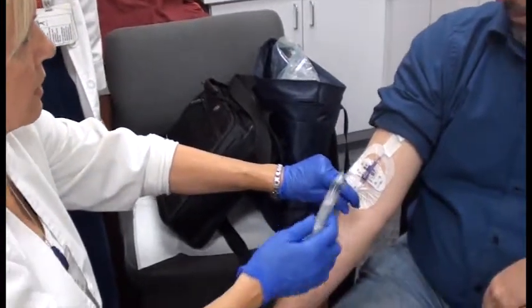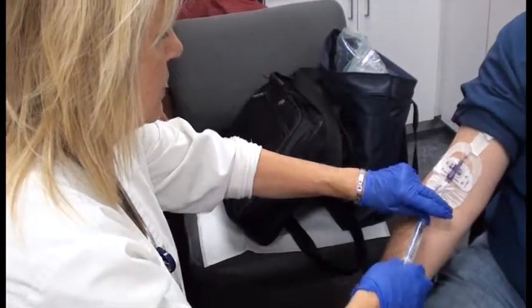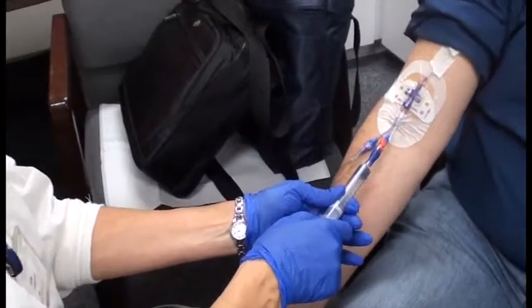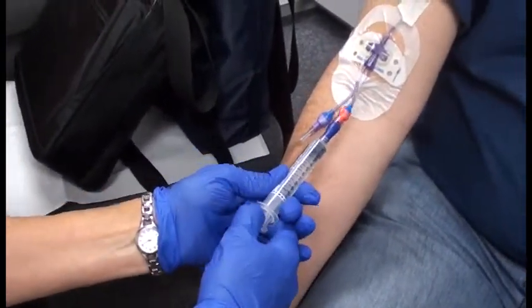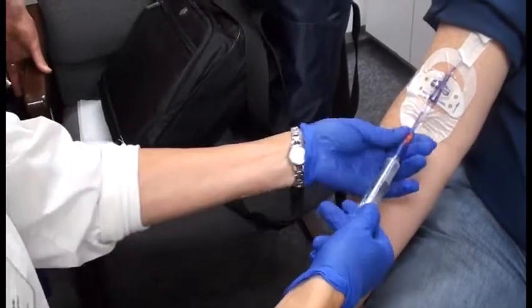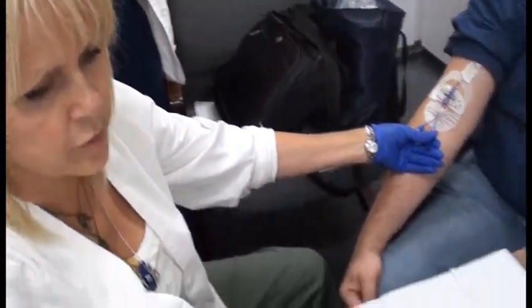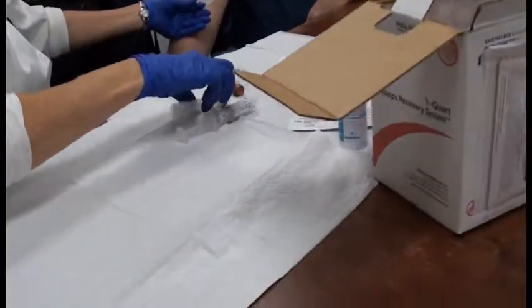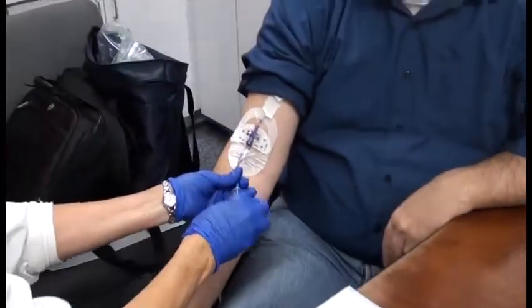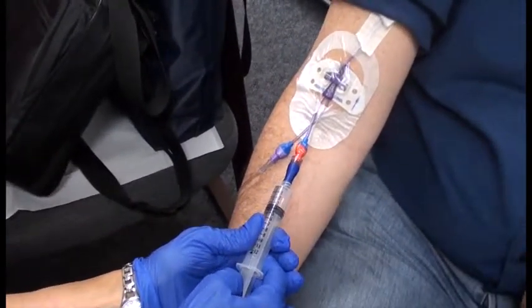Now I'm going to take a 10 ml syringe and hook it onto the end of the cap, and I'm just going to draw back 5 milliliters. So let's do that. And I'm just going to disconnect, and I'm going to put that in the sharps container. Connect you. I'm going to draw back the labs that I need.